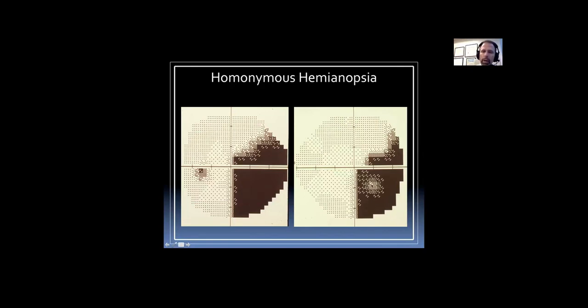But some years ago, there was a study, a report in, I think it was the journal Ophthalmology. The title of the study was Field of Dreams or Dreamed Up Fields. And basically what a neuro-ophthalmologist did, John Keltner, asked a bunch of medical students, he showed them grayscales like this, or a central scotoma, or a bitemporal field defect. And he said, do this on the field test. And pretty much every time they did it perfectly well.